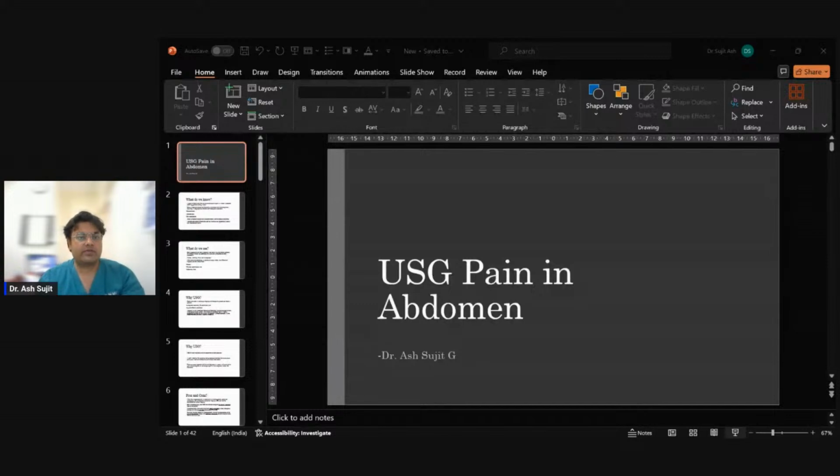Initially, the patient might present with pelvic pain, low-grade fever, infertility, and cervical motion tenderness. Fever and leukocytosis, as we discussed, are often vague and not very specific. Imaging studies, therefore, play a crucial role when you think about the diagnosis and subsequent management for the patients. Among the sonographic findings, early on you might not find a pyosalpinx or tubo-ovarian abscess because it might be very early, but you can find enlargement of the uterus and the ovaries with indistinct soft tissue margins, thickening of the broad ligaments, and fluid in the cul-de-sac or the endometrial cavity.